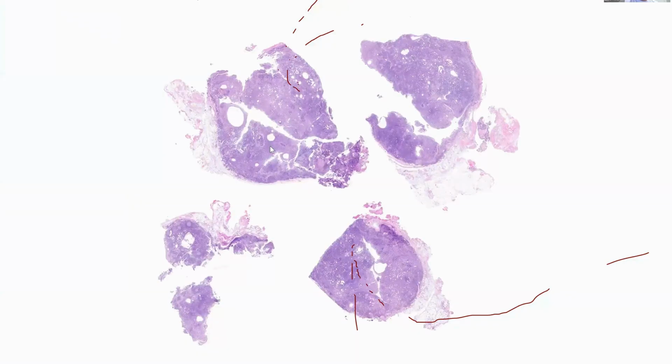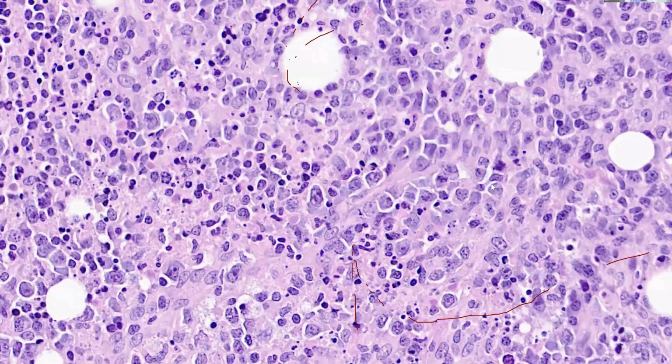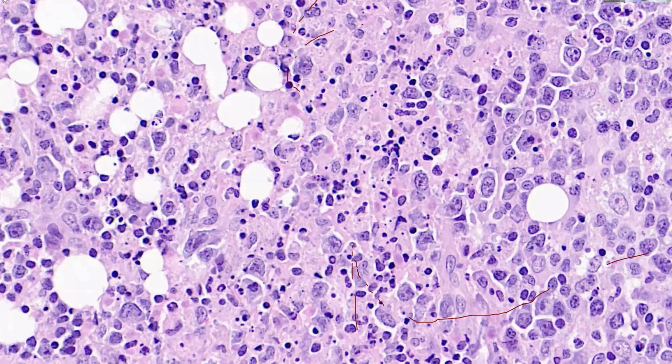So this is an example of a case that was diagnosed as a T cell lymphoma, peripheral T cell lymphoma with CD30 positivity. You can see the mixed population of background cells, including neutrophils, apoptotic bodies, and histiocytes, but you can see sheets of these large atypical cells. And if we look harder, there are cells that look like Reed-Sternberg cells.